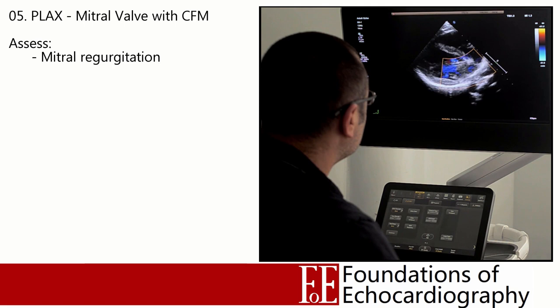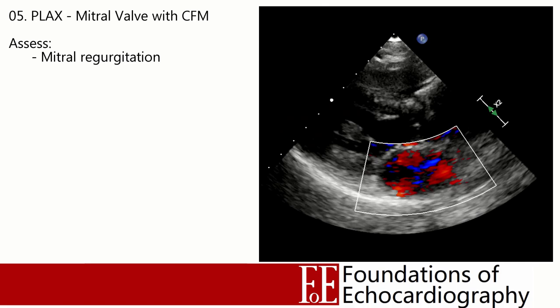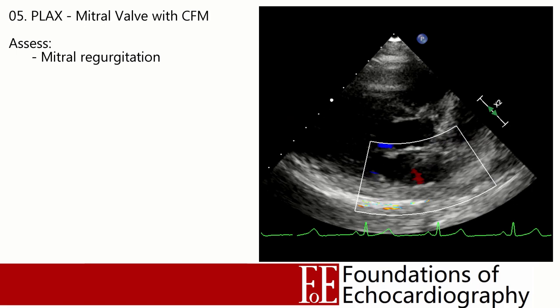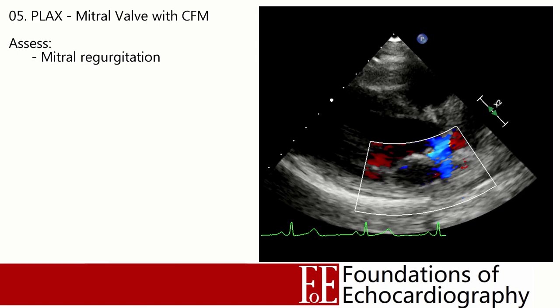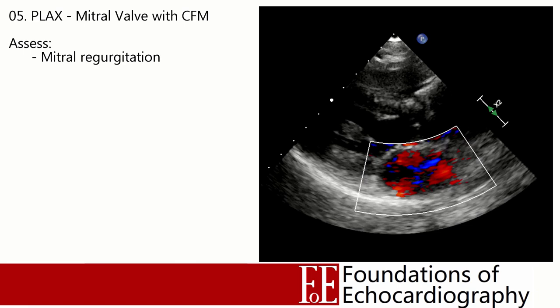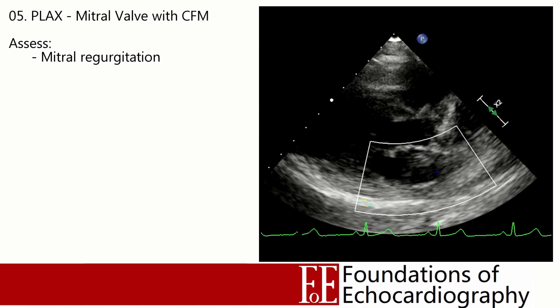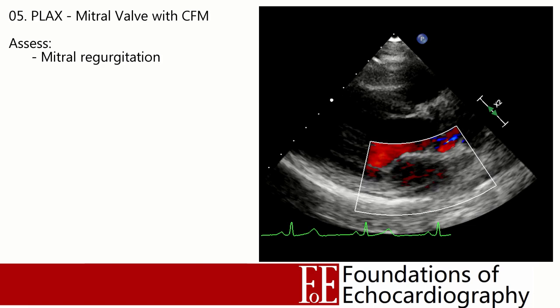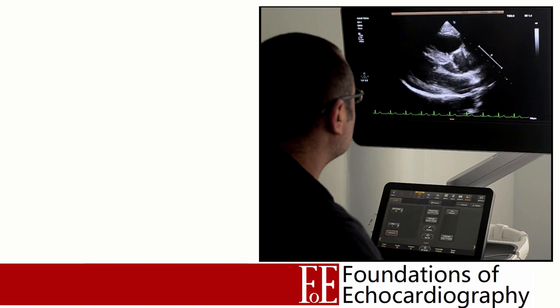Once we've evaluated any aortic regurgitation and confirmed there's no turbulent flow within the outflow tract, move the colour box down to cover the mitral valve leaflets and left atrium to look for regurgitation. Just as before, pan through the valve by tilting the body of the probe in one direction until the valve leaflets disappear, then back in the other direction. With mitral regurgitation in particular, it's very easy to miss a regurgitant jet if its origin is away from the centre of the valve leaflets.